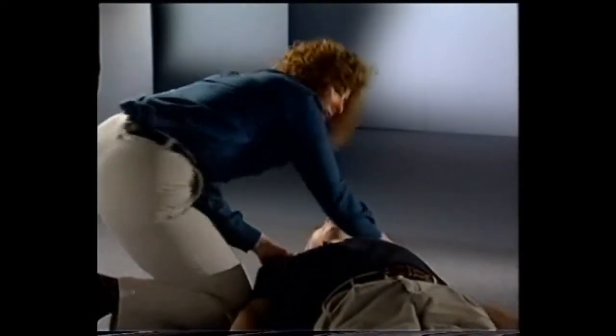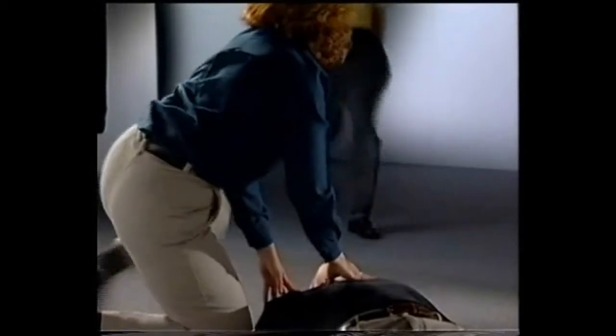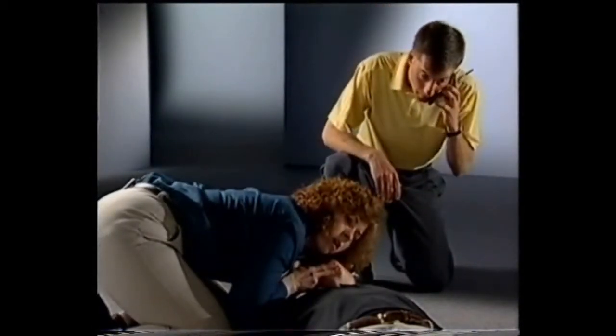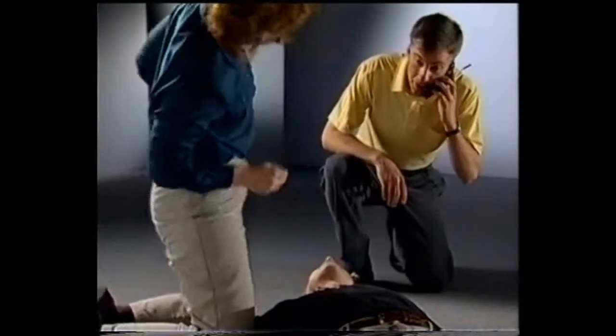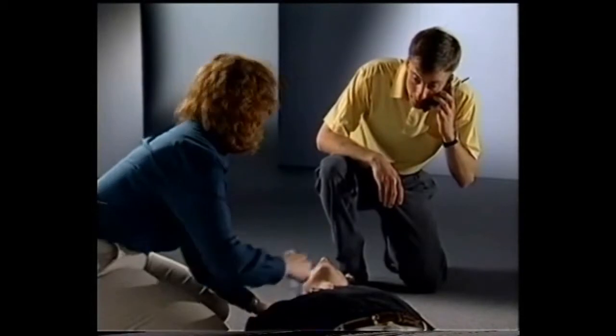Sir? Sir? Sir? Help! Sir? Sir, somebody help me! I don't know, I just found him like this. Call 911. I'm going to start CPR. Yeah, this is an emergency. We have a man that's fallen down in the lobby. He's unconscious. There's a defibrillator just around the corner. Go get it. Yeah, we've started CPR.